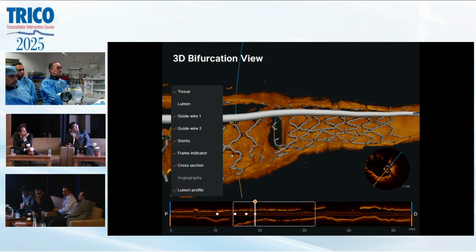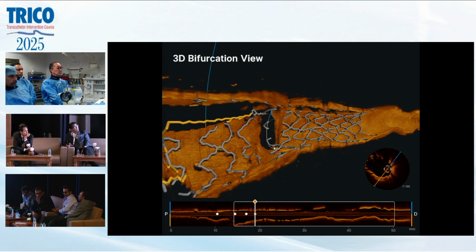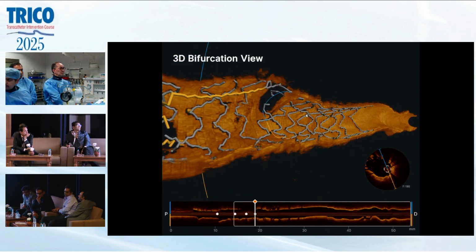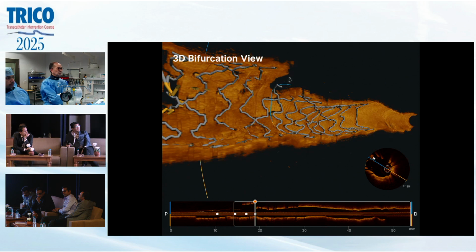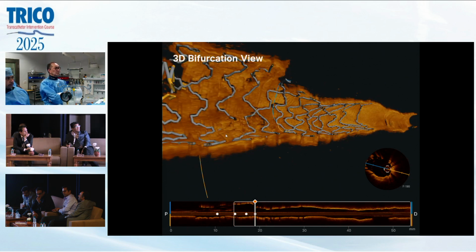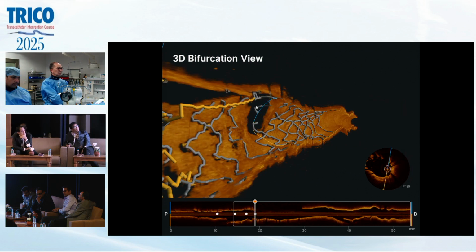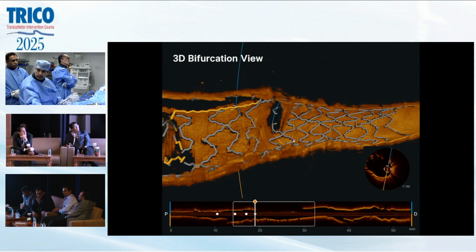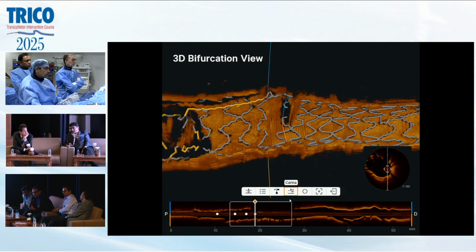Okay. Yeah, here is the bifurcation, right? Yeah, two links, yes, over, right? Try to check here. Rotate. Yeah. Yellow color is wire, right? Yeah. Can you understand? Can you explain a little bit more? Yes.